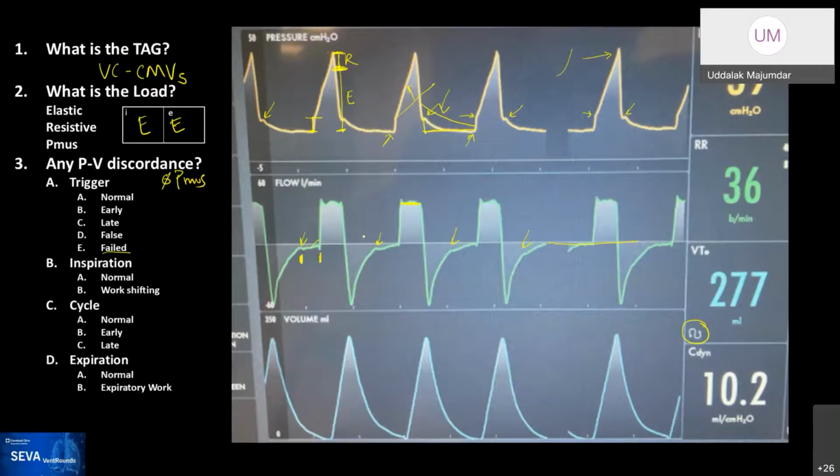Yeah, we actually did a very nice one, that was Matsuba. We had a couple of cases, one reported by us, and the other one was a Twitter submission that demonstrated the flow waveform. So if you go back into the YouTube chapters that we have, you're going to see one that is called expiratory trouble. And Matt describes what we saw there very nicely. There's two very nice examples of expiratory flow valve failure. Okay. Yeah, thank you. No problem.